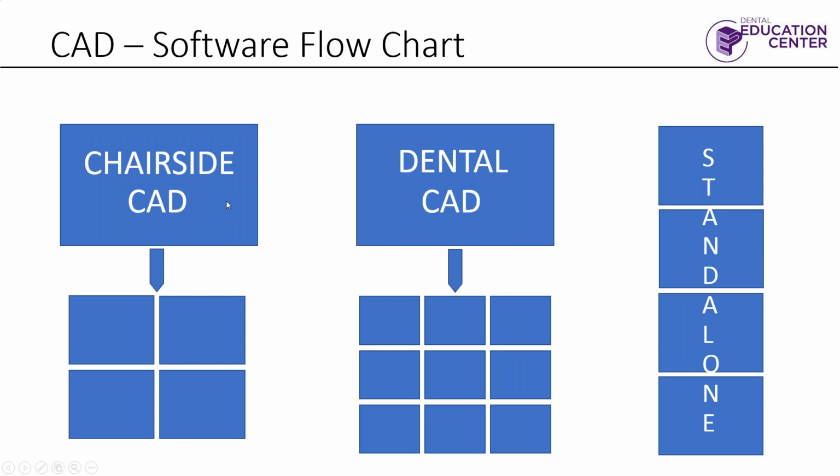There's the chairside, which is really designed for chairside single units, fast and accurate as fast as possible. Dental CAD, this is kind of the laboratory world, but there is quite a few dentists that are in the dental CAD world. I know Dr. Shank uses the full-blown software, where it does everything and anything. Then there's standalone modules that you just don't need base software for. It's a very hyper-specific software specifically for one type of purpose.